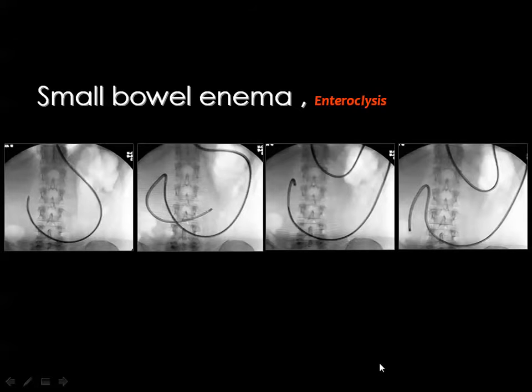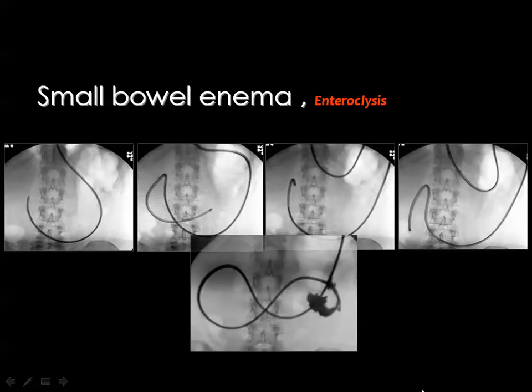And this is in a template, and you can see this is the tube, which is curving inside the stomach, and then you go until you reach the jejunum. Then if you are lucky and skilled enough, you can reach the jejunum, and you start the injection of barium, and you delineate loop by loop in order to avoid the overlap of each loop whenever the contrast is taken orally.